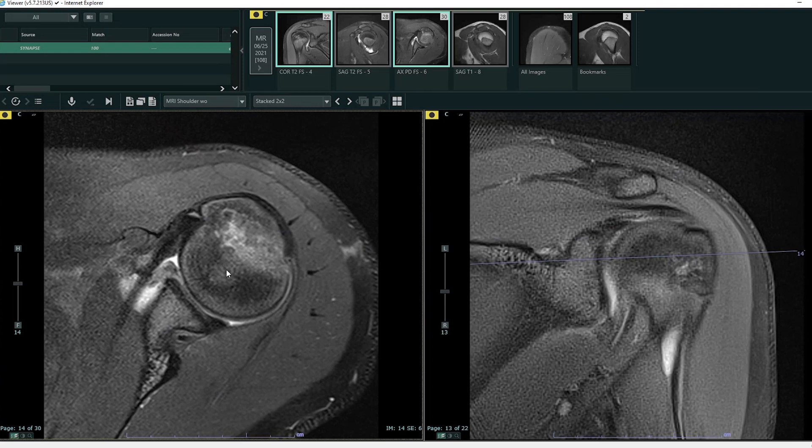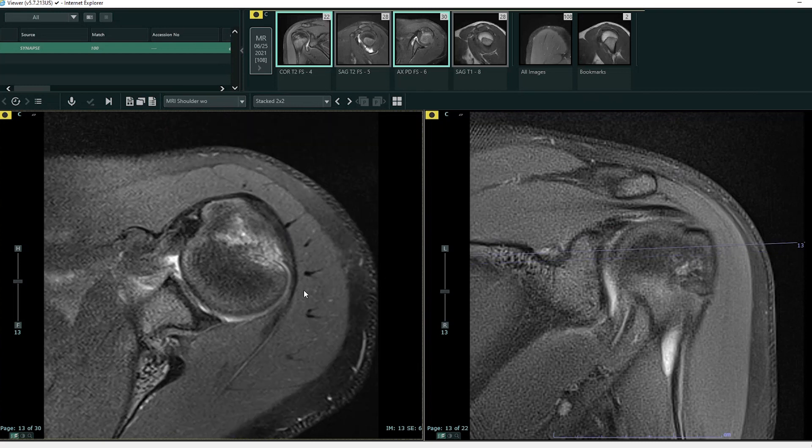This is a patient who came in with shoulder pain. They described that their shoulder felt like it popped out, and this happened while they were doing an athletic activity. This patient had an anterior glenohumeral dislocation, so let's look at some of those findings.